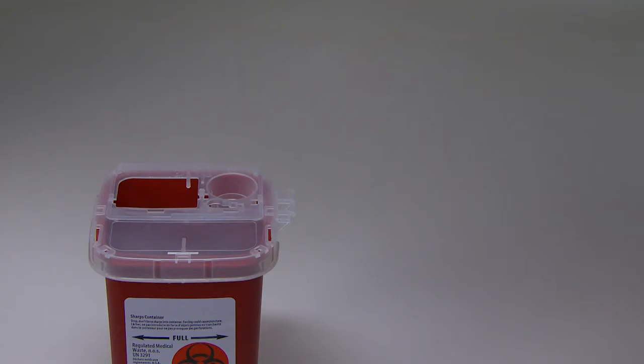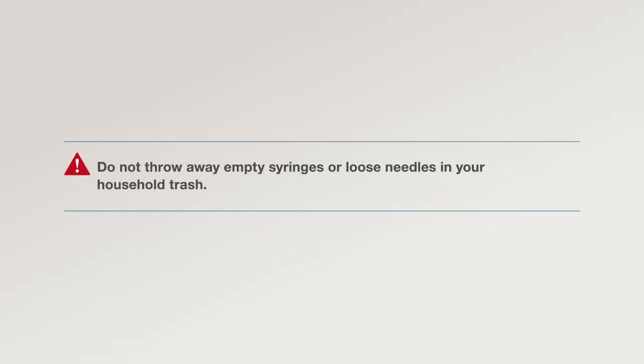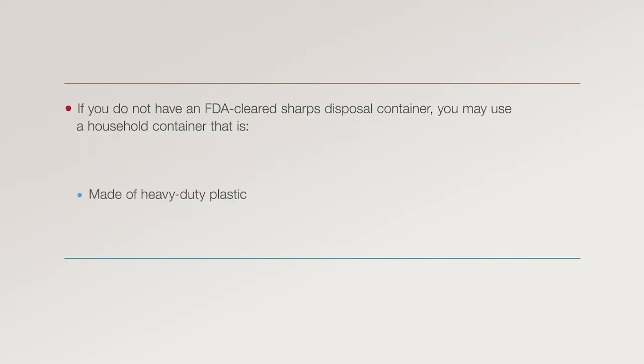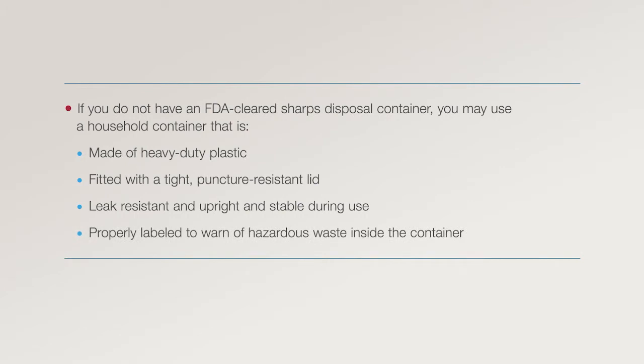Step 4. Disposal. Discard the empty syringe in your sharps container. Do not throw away empty syringes or loose needles in your household trash. If you do not have an FDA-cleared sharps disposal container, you may use a household container that is made of heavy-duty plastic, fitted with a tight, puncture-resistant lid, leak-resistant, upright and stable during use, and properly labeled to warn of hazardous waste inside the container.